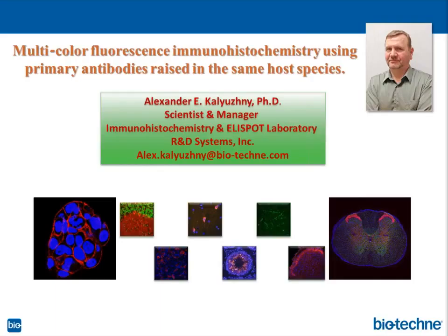Okay, and now Amir asks if you have any suggestions for antigen retrieval, like 1% SDS for 5 or 10 minutes or something like that. Antigen retrieval is not actually, I would call it voodoo science, because no one knows how it works, and we use different antigen retrieval protocols. We use TRIS buffer pH 9, we use citrate buffer pH 6, and I don't think I can give you recommendations. It's pretty much whatever works the best when you get the strongest signal with the lowest background. We get very good success with TRIS pH 9.